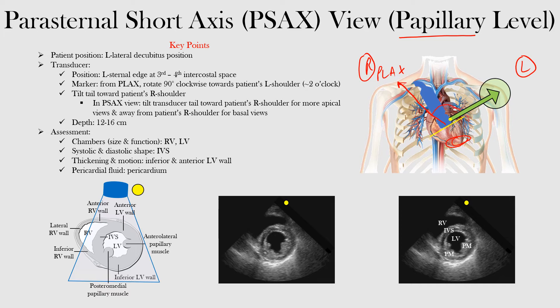In the parasternal short axis view, what we do is rotate it clockwise towards the patient's left shoulder — around two o'clock. And what we're doing now is, once we have it in that position, there are multiple levels we can look at. We can look at more of an apical view, down towards the apex, or more of a basal view. The basal view may give us an aortic valve level, while the more apical view would be more of the papillary level that we're looking at here.